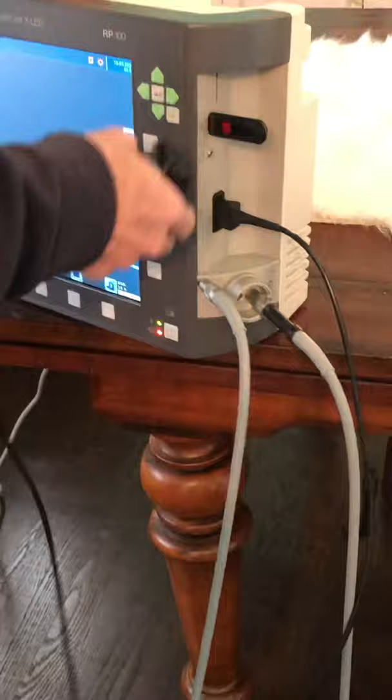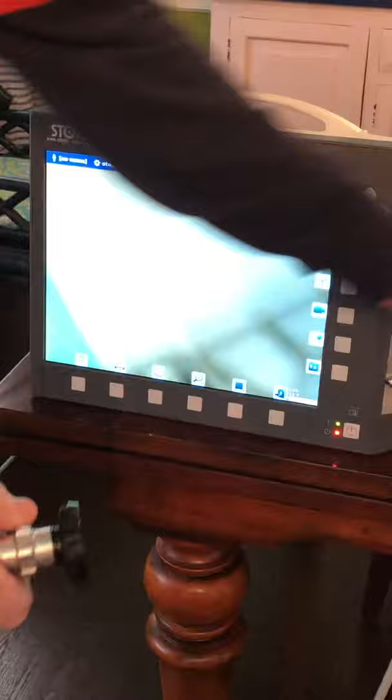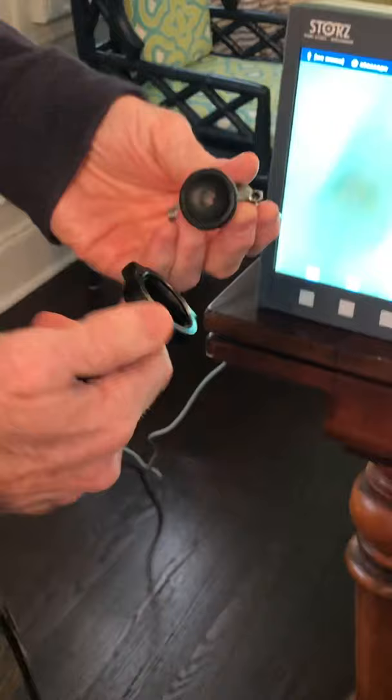Once you do that, you'll have your live image up on screen. Then take your rigid scope with a standard eyepiece — rotate the black ring and put the eyepiece inside, then let it go. Check to make sure it's seated in there.